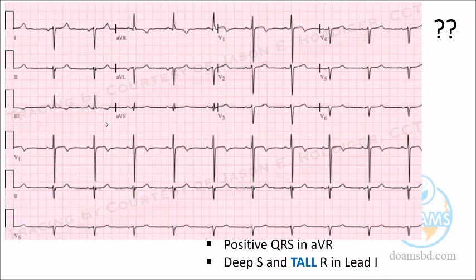So the question is very specific. Please, anyone can say. Dextrocardia, I think, doctor. Yes. So the tall or small R wave is an important feature to differentiate dextrocardia and wrong lead replacement.